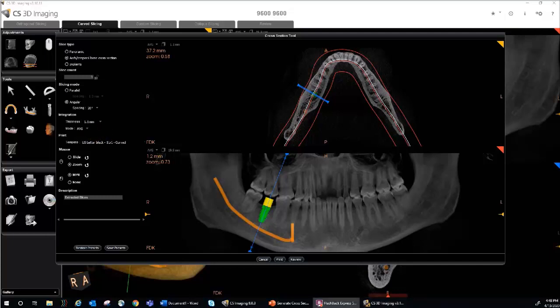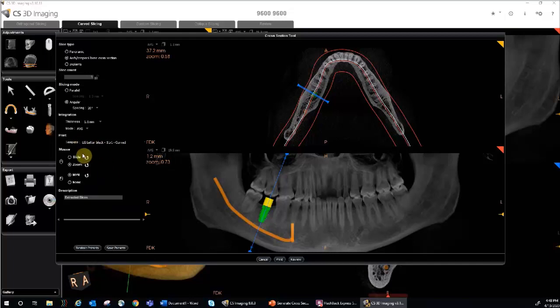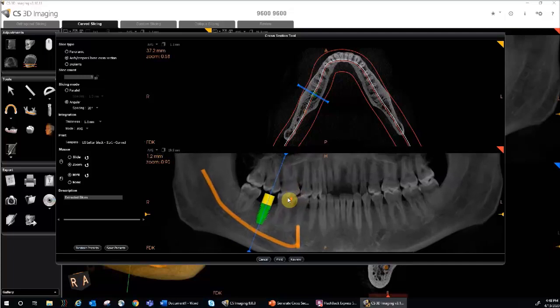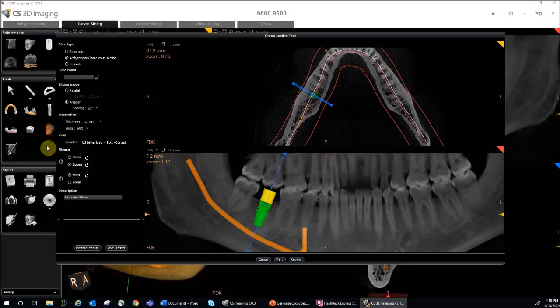In the print area, you can choose which template is brought up when you generate the report. In the mouse section, you can choose the function of your scroll wheel — you can set it to zoom or to slide. Right now I have mine set to zoom, so if I move my cursor over the image and roll the wheel, notice it zooms in. If I change it to slide, instead of zooming, it will go through each slice.